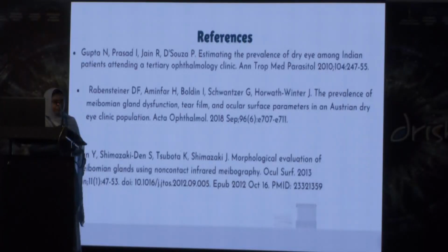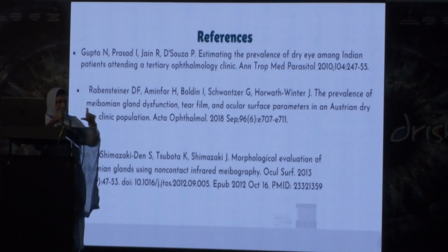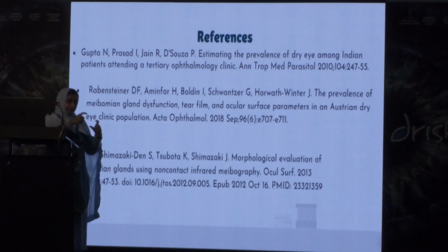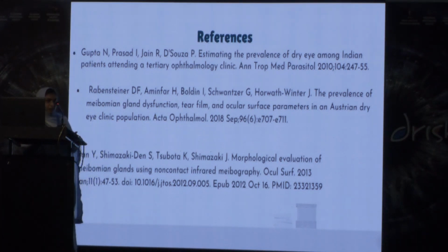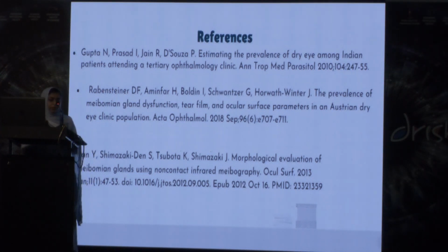Was there any difficulty in finding this dropout of the meibomian glands? Initially, it was actually only observer based. That is, the machine shows a specific area. So if we delete some area of selection, it will give us an error value. So after the pilot study with 20 patients, we found out that we need to actually take the exact overlid or specify an area, which the machine normally showed. This was the only difficulty.